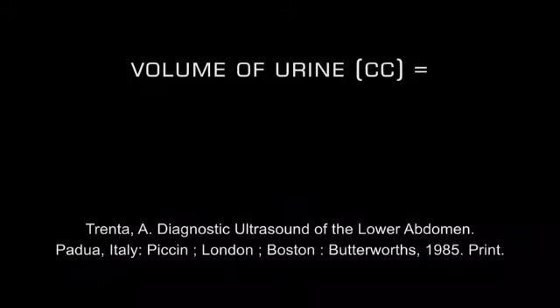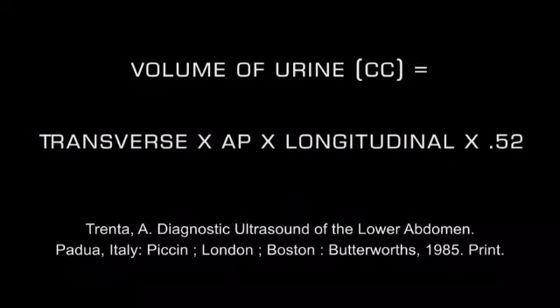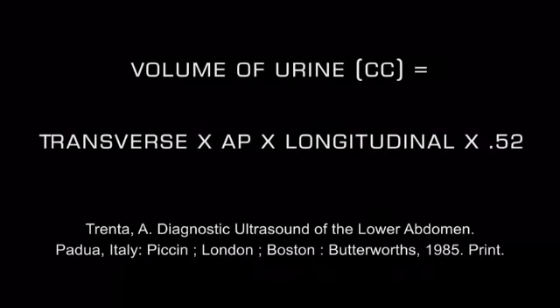The volume of urine can be calculated by multiplying the 3 dimensions of the urinary bladder with a correction factor of 0.52.